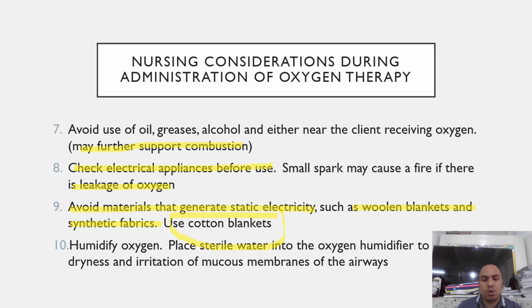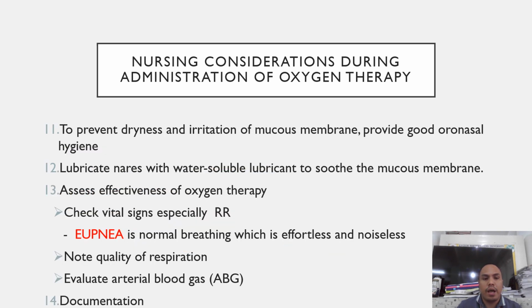Humidify oxygen. So place sterile water into the oxygen humidifier to prevent dryness and irritation of the mucous membranes of the airways. Provide good oronasal hygiene. We need also to lubricate the nares with a water-soluble lubricant to soothe the mucous membrane.